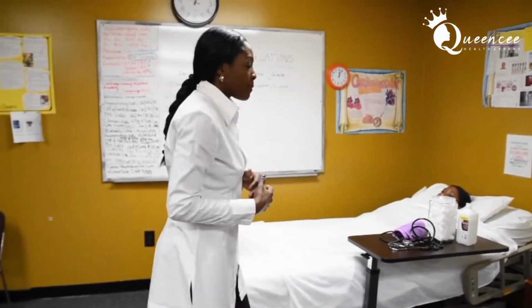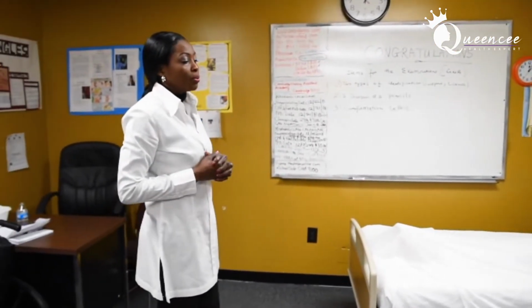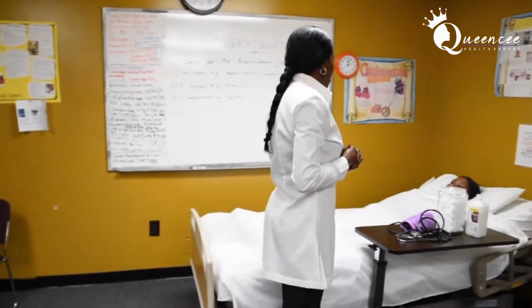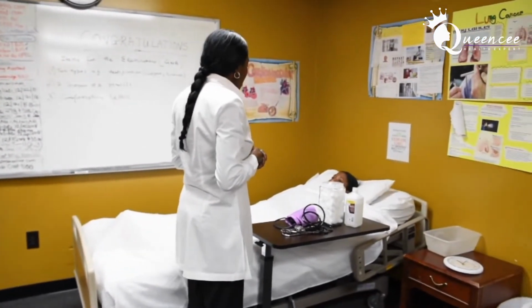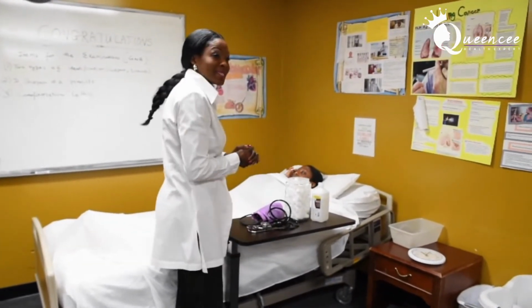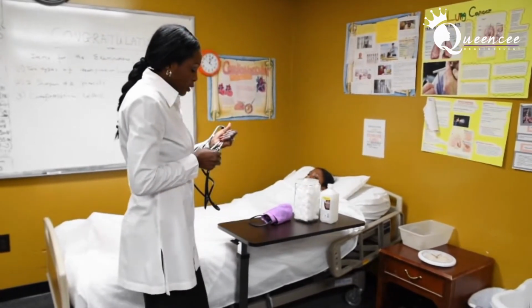This is my exam. I've looked on my exam form and it says measure and record blood pressure. This is what you will do once again. Hi, Ms. Nafisa, I'm here to take your blood pressure. Is that okay with you? Great. I have my equipment here, and the examiner will get up from their seats and come to the bedside of the patient to do the skill with me.